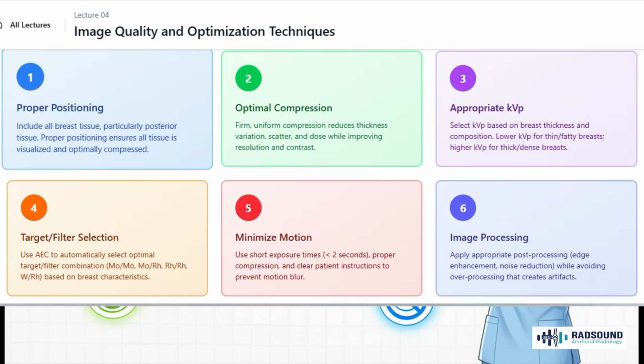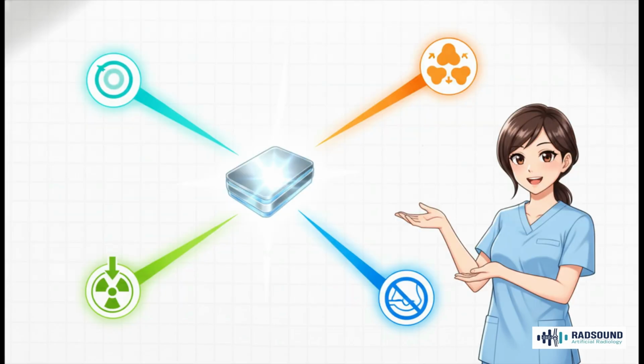It makes the breast thinner, which lowers the dose. It spreads the tissue out, which improves contrast. It brings everything closer to the detector, which improves resolution. And it holds the breast still, which gets rid of motion blur. It's a win, win, win, win.